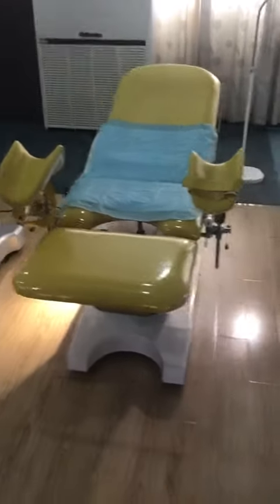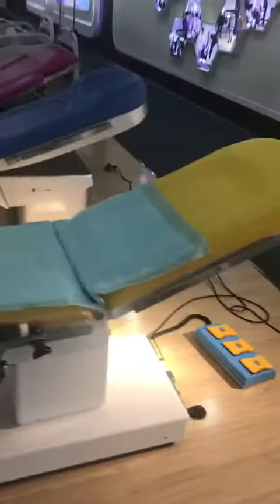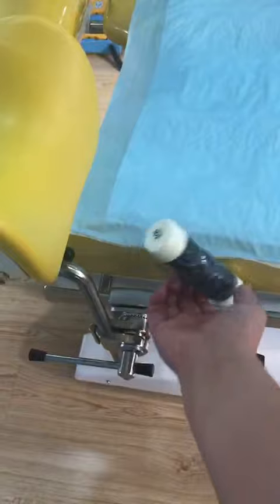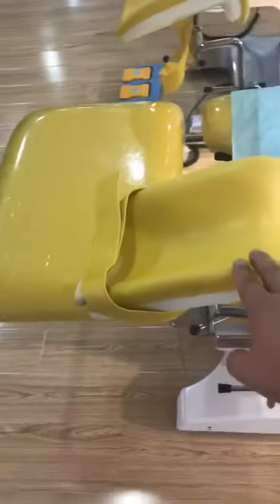This is our gynecological exam table FS.1. It consists of the backboard, thickboard, and footboard with accessories. One pair of handles — you can adjust the distance — one pair of leg support, and the legboard is removable.